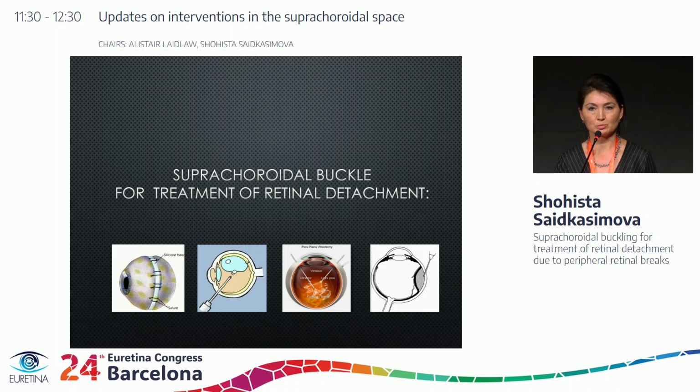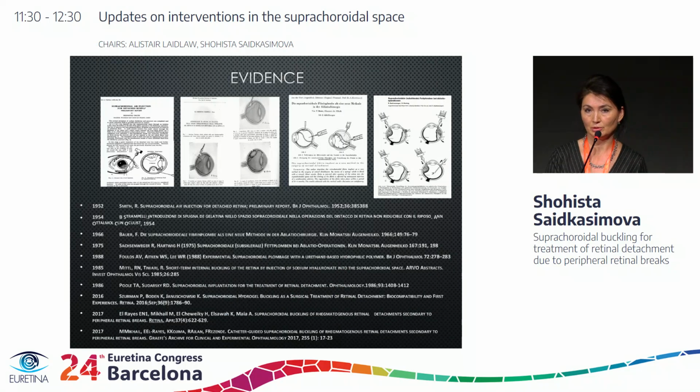And I'm going to throw the suprachoroidal buckle into the mix because I strongly believe that there's certainly a very solid space for it in selected cases of retinal detachment. And I will tell you how I have arrived at this conclusion. So the concept is not new. It's been explored for quite some time now.